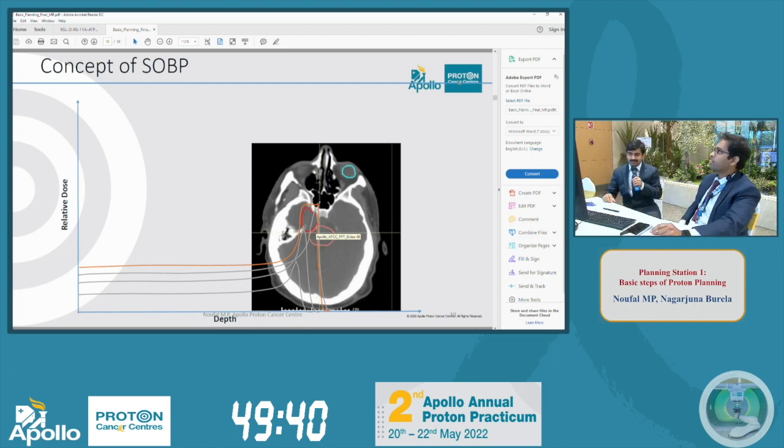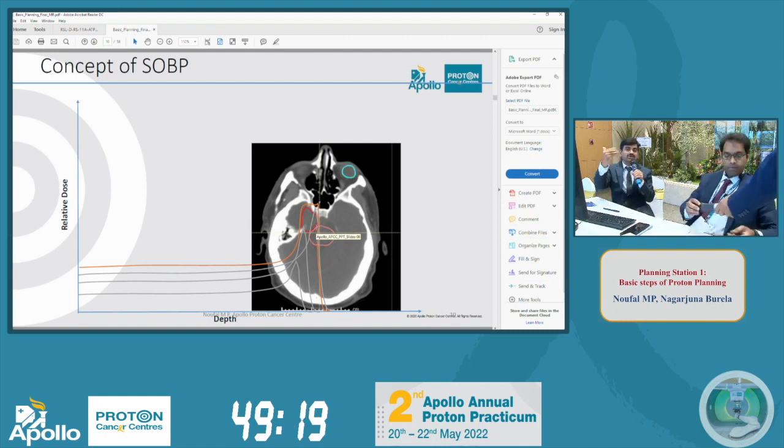Thank you, Nag. That's a very important question, because as far as the planning is concerned, now you understood what SOBP is. One important point to keep in mind is that we know the proton is going to stop, but at the same time, we don't know where the proton is going to stop.